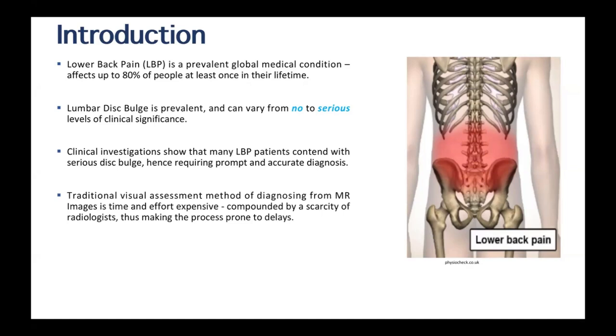accurate diagnosis. Traditionally, the way of doing this was the visual assessment method. For example, if you complained of serious back pain, you would get booked for an appointment with the NHS, after which they could recommend you go for an MRI.